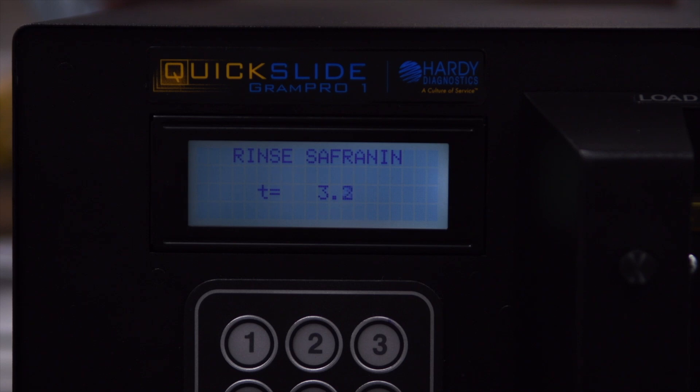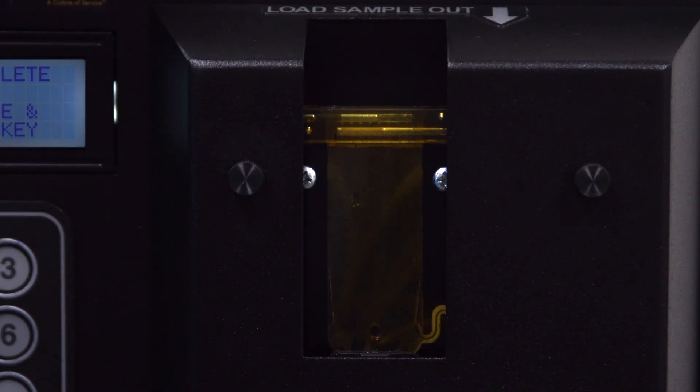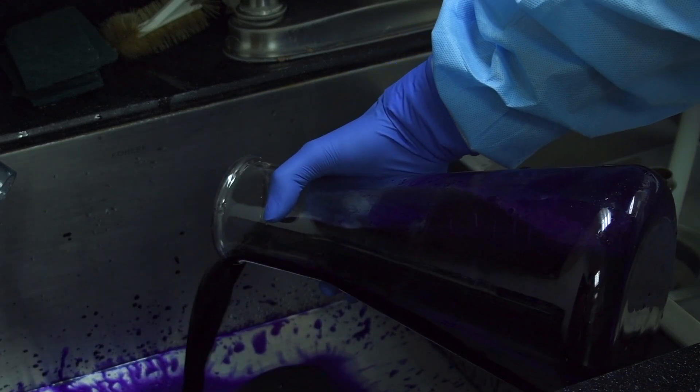When the final rinse step is finished, the machine will make an audible alert to notify the operator that the stain is complete and the slide can be removed. The GramPro1 does not monitor the waste level, so be sure to empty the waste container to avoid an overflow.